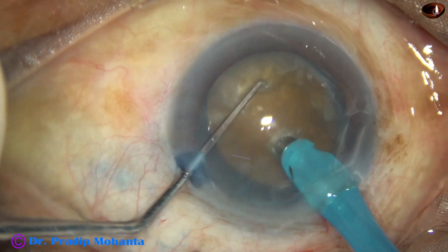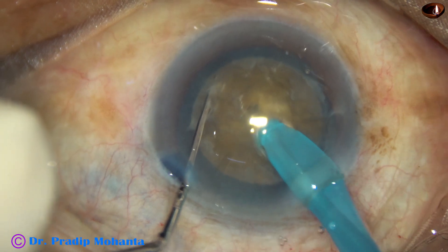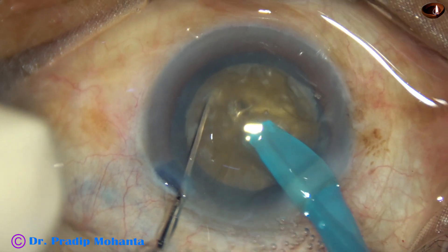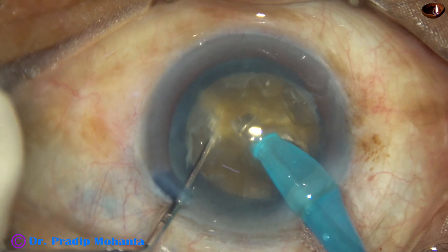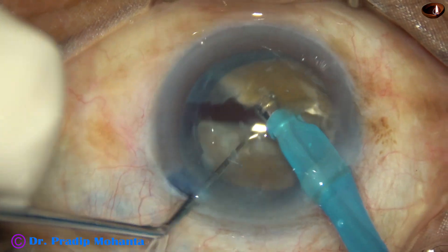The nucleus is pushed a little down, the tip of the phaco needle goes in, and it travels through the substance of the nucleus towards the posterior crater. Then the chopper is used to crack the nucleus.